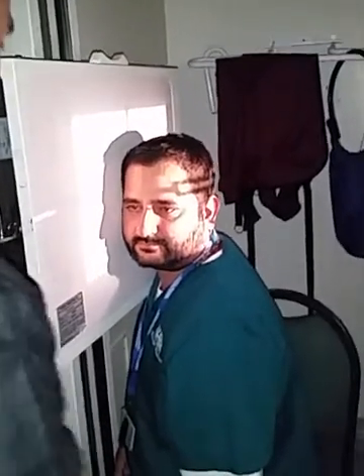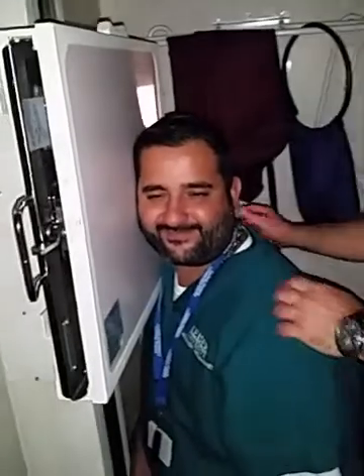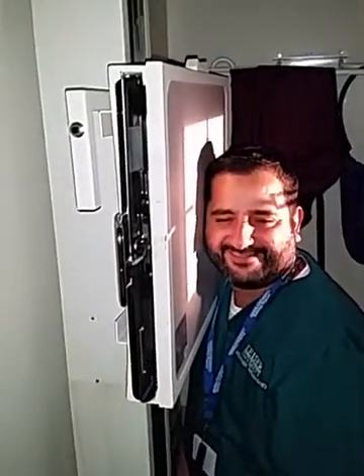His nose is a little crooked though. Sorry. I'm looking 3 times. Oh, wow. Okay, we'll shift it that way. So, relax, buddy. It's okay. It's all good. It's all good, man.